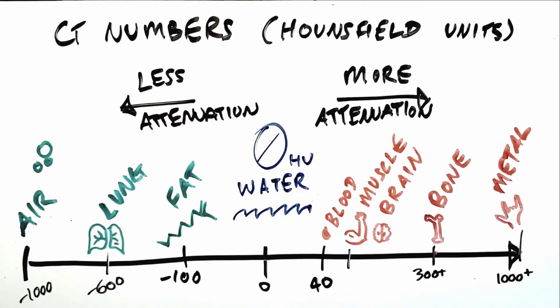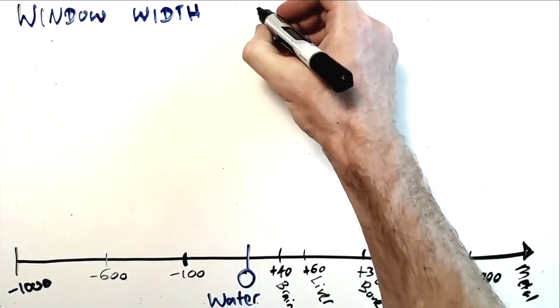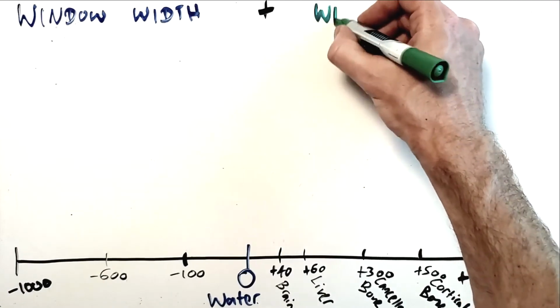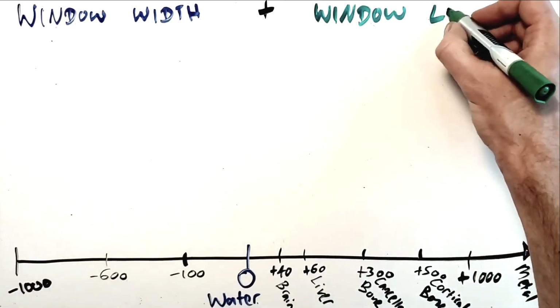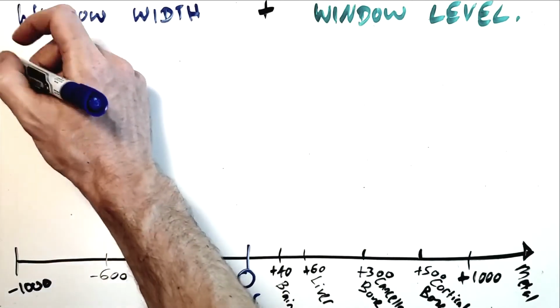This calculation means that the lowest possible CT number is minus 1000 Hounsfield units, and most of the body's tissues fall well below the plus 1000 level, with the exception of dense cortical bone, which can be as high as 1500 or 2000, and metal implants, which can be even higher. So now that we have this nice neat scale in a range relative to the number 0, we can use those CT numbers to assign grayscale values from black to white and anywhere in between to show those tissues in a variety of shades of gray.